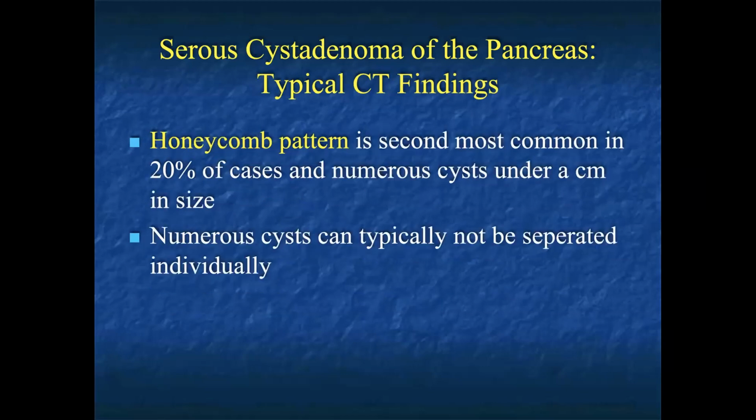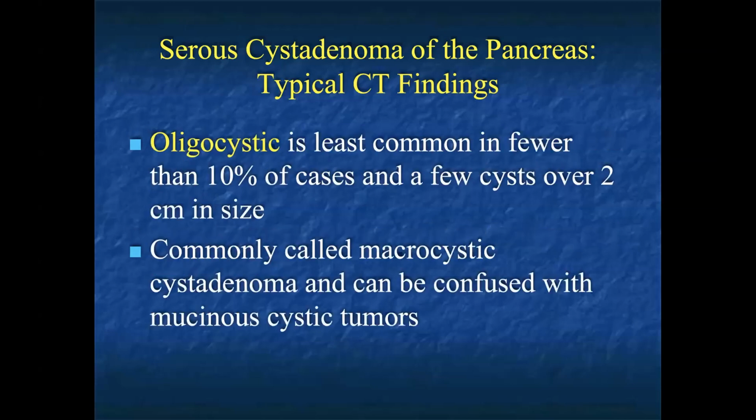When I talk about calcifications in the pancreas, that helps me. Adenocarcinoma never calcifies. Occasionally, in a patient with chronic pancreatitis who then develops adenocarcinoma, you'll see calcifications near the tumor. Mucinous cystic neoplasms commonly calcify around the edge. Patients with serous cystadenomas, the calcifications are central. Patients with neuroendocrine tumors, often the calcifications are dystrophic.